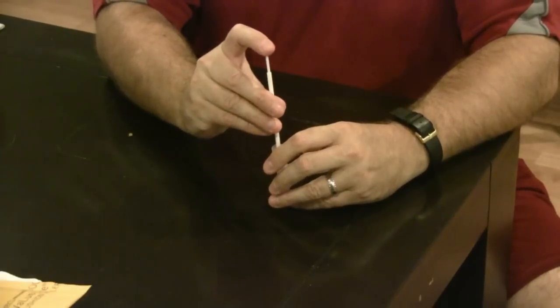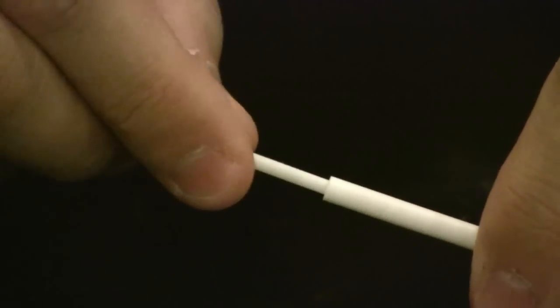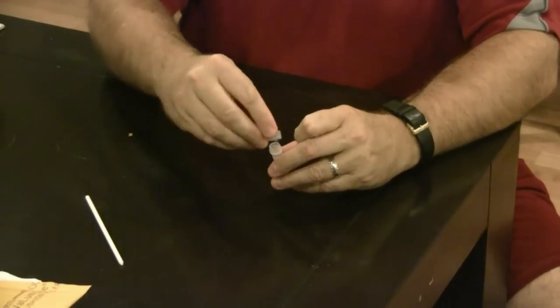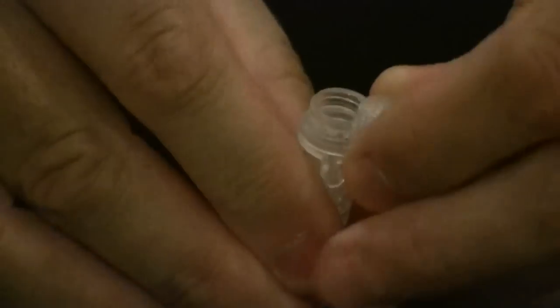Repeat that process for the other swabs you have in your kit. Put the brush into the vial and depress the plunger — that will cause the brush head to release into the vial, so you get the brush head off without having to touch it.